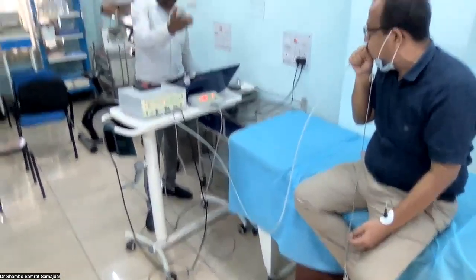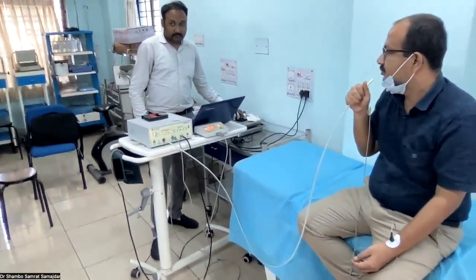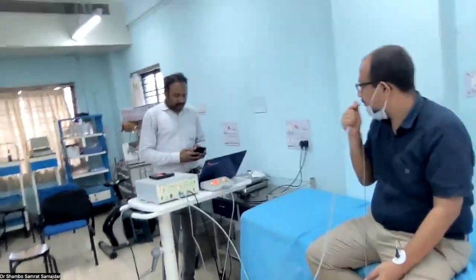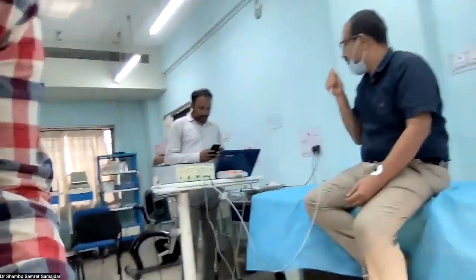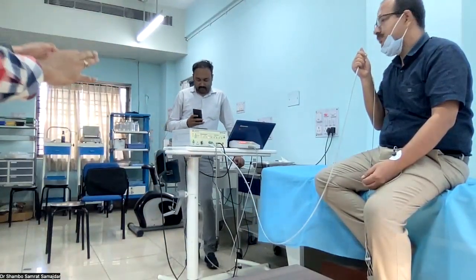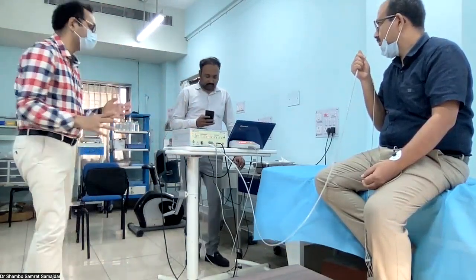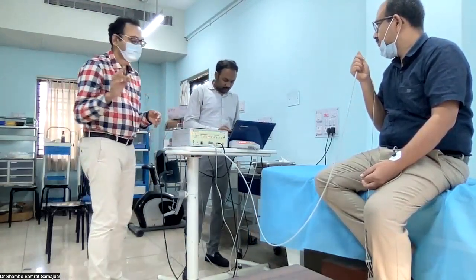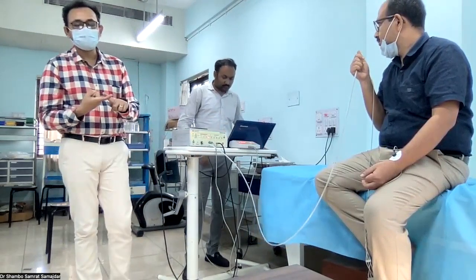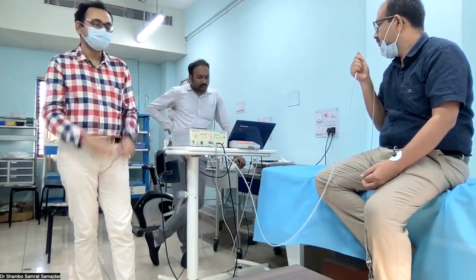So for 15 seconds. So for 15 seconds, it is very important. We need to ask our patient to blow it at the 40 millimeter of mercury pressure for 15 seconds. So this timing is again very important. We need to remember two things here: 40 millimeter of mercury pressure for 15 seconds.